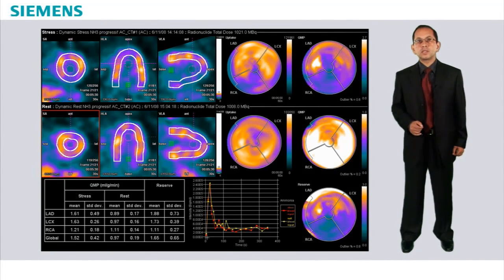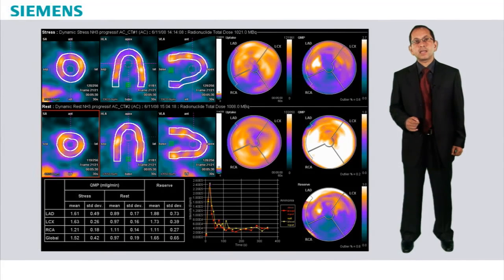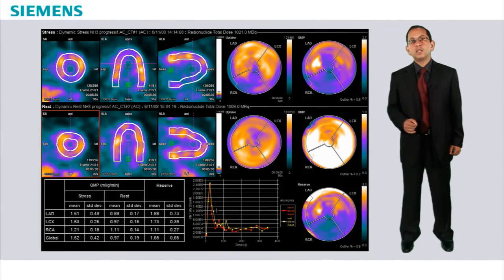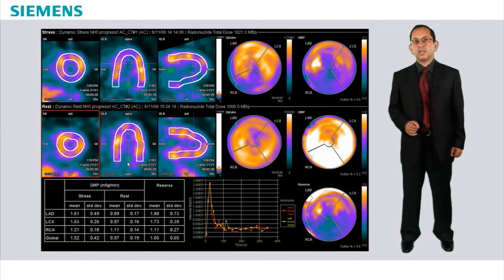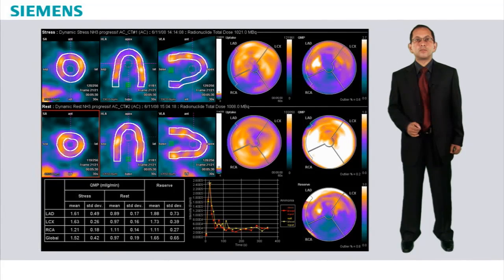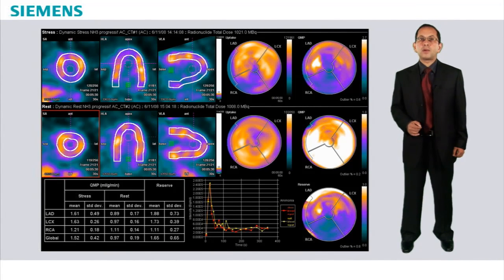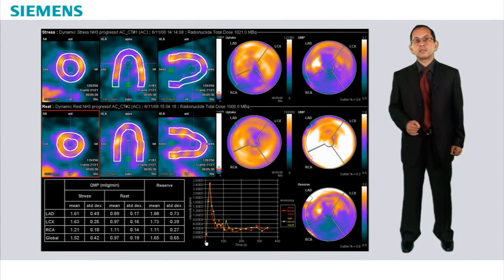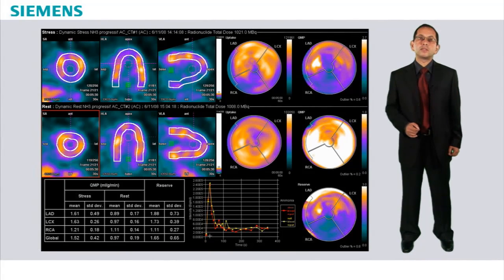The adequacy of the bolus can also be checked via the time activity curve of the input function. The input function is sampled from a region of interest in the left ventricle highlighted in green. We see the sharp upslope of the time activity curve as the initial bolus passes through, followed by rapid clearance, which indicates that the arterial input function is adequate.